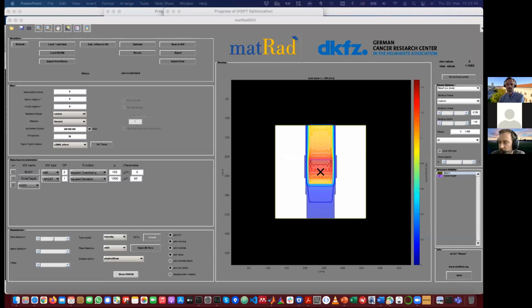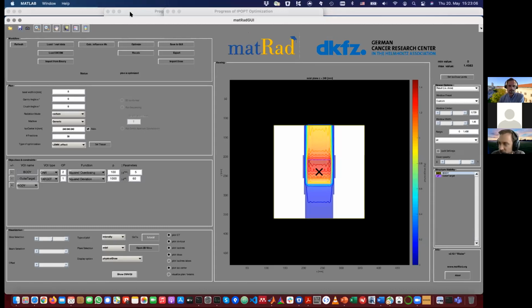In principle, you have a state-of-the-art publication saying this tissue has this alpha beta ratio and that tissue has that alpha beta ratio, and you have some measurement there. What I know is that you need to be very careful to pin down, like I said, and then you rather go with a more conservative choice on the alpha beta ratios that may not allow you to exploit the full tissue difference, or the best distribution of carbon ions that you would get if you knew the alpha beta ratios exactly. But you need to be quite conservative when choosing them and go rather safe than sorry.